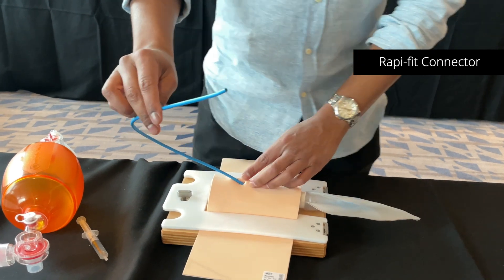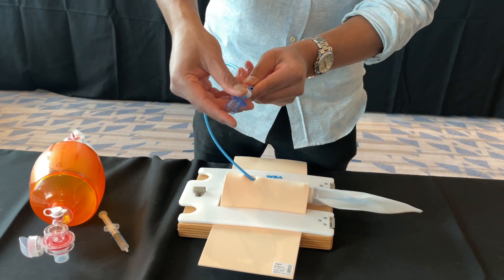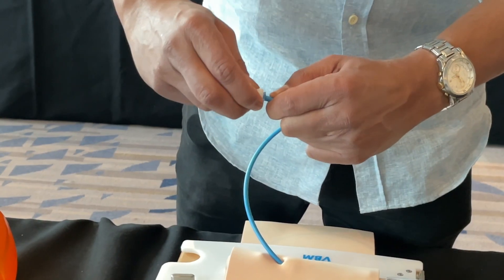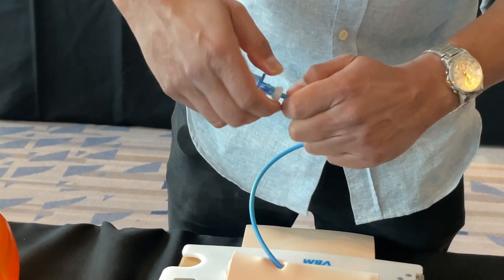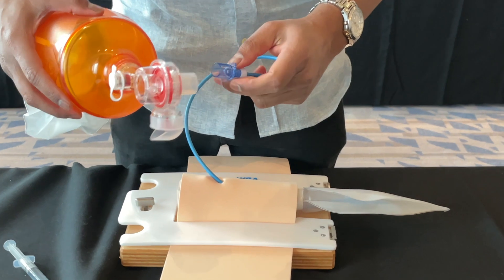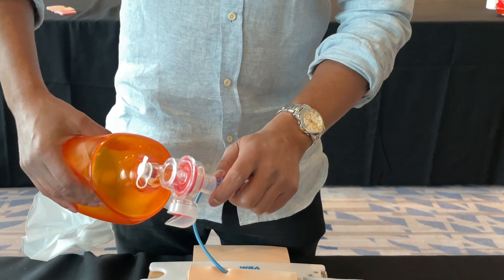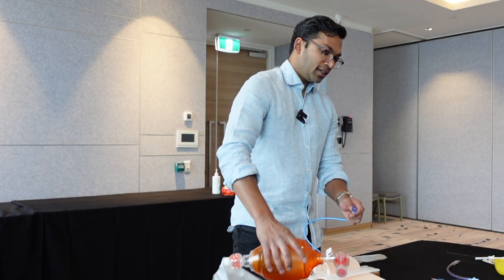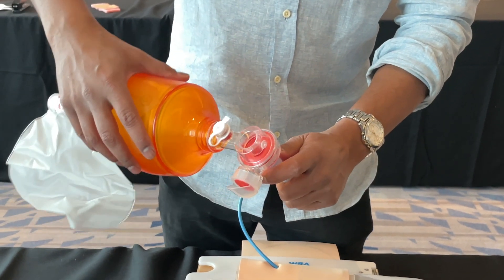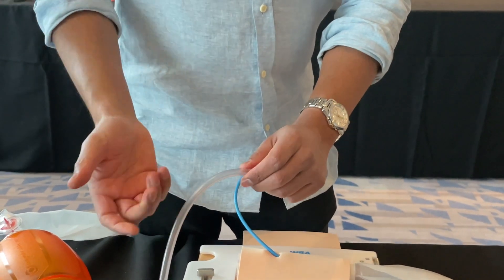Once in the airway with the bougie, the technique describes using a rapid fit connector — you insert it onto the end of the bougie and clasp it with the white locking device so it's firmly fitted. This connects to a standard 15-22 millimeter connector for oxygenation. While this gives oxygenation faster, using this connector may be slightly slower because you can't achieve the same pressure level. Some rapid fit connectors have a Luer lock for connecting a jet ventilation device to get rapid oxygenation.